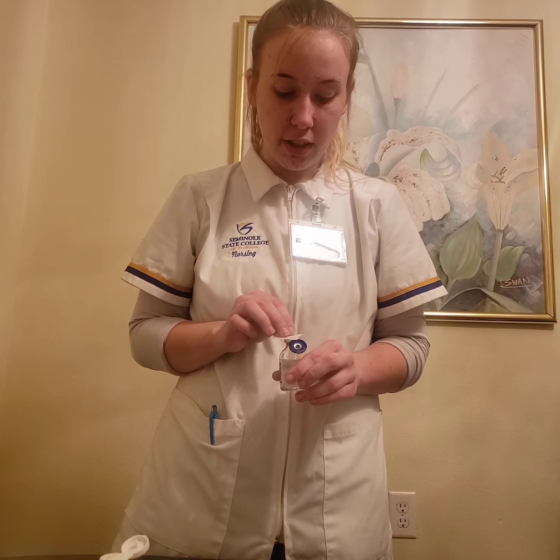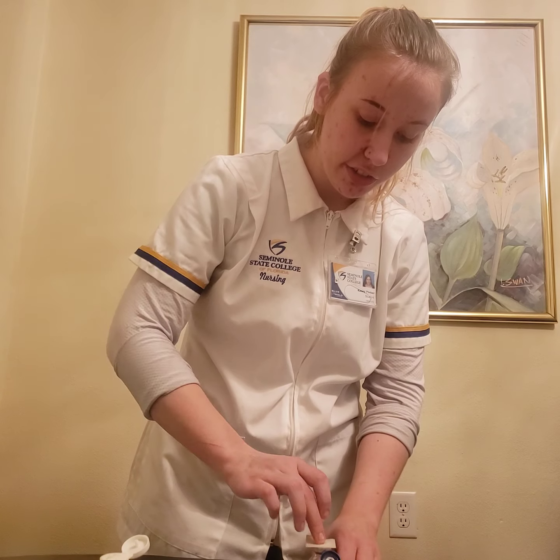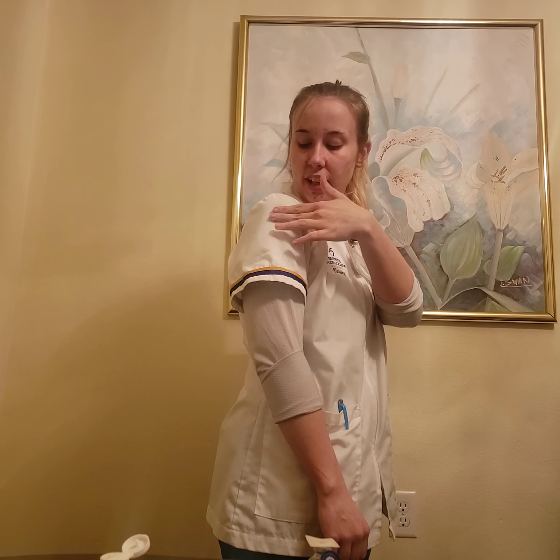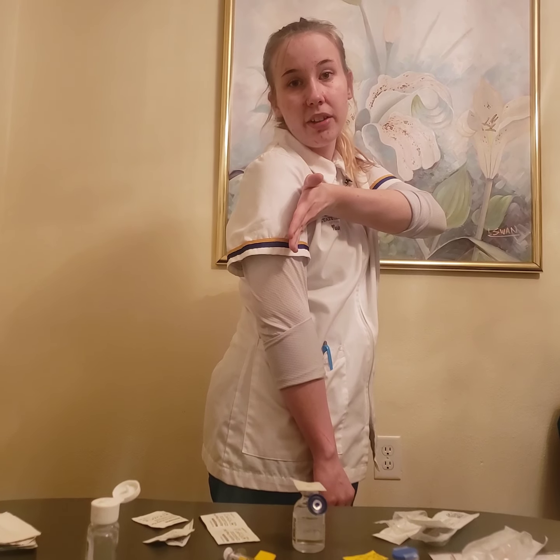Now I know I need to be giving the IM injection in one of 3 areas on the patient. I can use the deltoid muscle. So to find this, you find the bony aspect here. You want to go 1 to 2 to 3 finger widths down and create a triangle with your thumb. This is going to be your injection site here, and we're using Z-Track to give the injection.